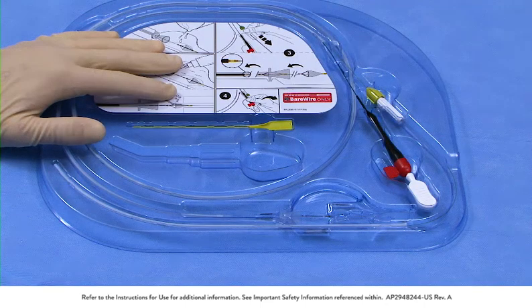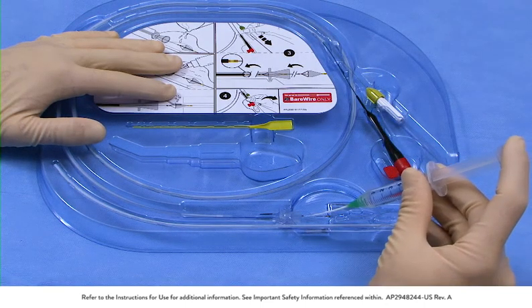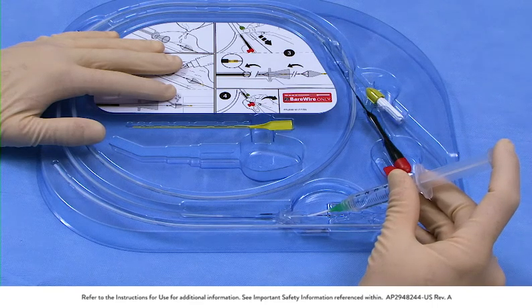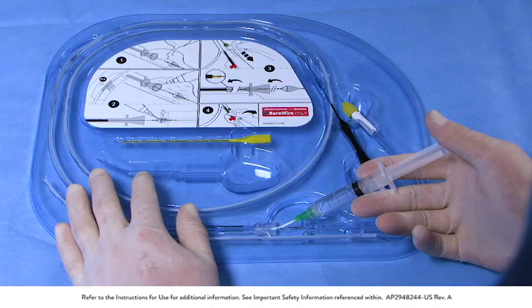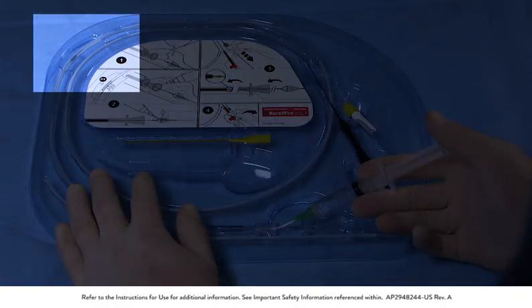To flush the delivery catheter, push the white flushing tip into the core of the loading funnel until it engages the internal diameter of the funnel. Flush the catheter lumen until heparinized normal saline can be seen exiting at the rapid exchange exit port.